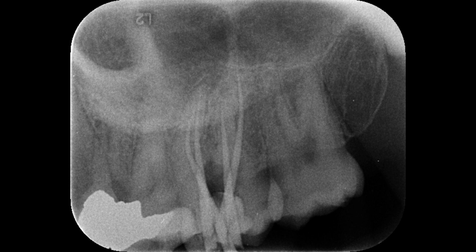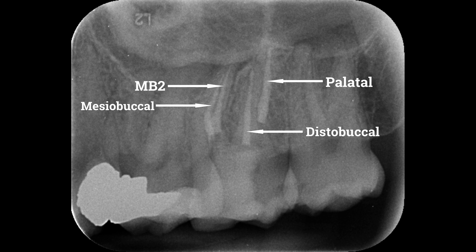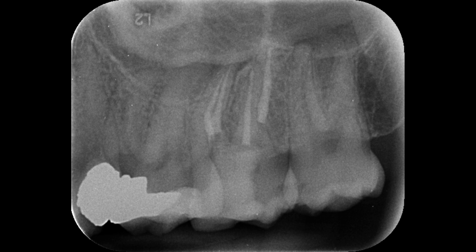All four canals are visible here. After obturation I did the restoration. Here is the final radiograph. This is the mesiobuccal canal, this is the distobuccal canal, this is the palatal canal, and this is the MB2 canal. This is the distal view radiograph where you can see all four canals clearly. After that I placed a composite restoration.